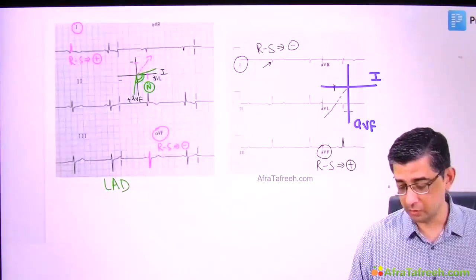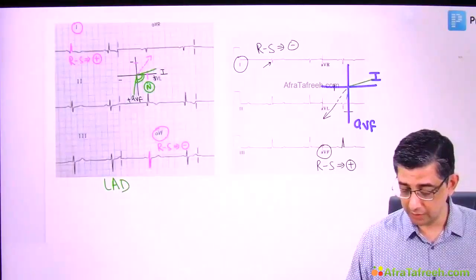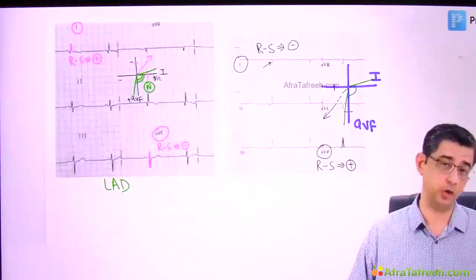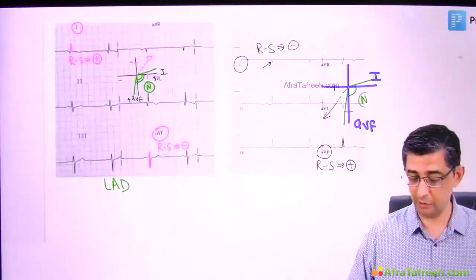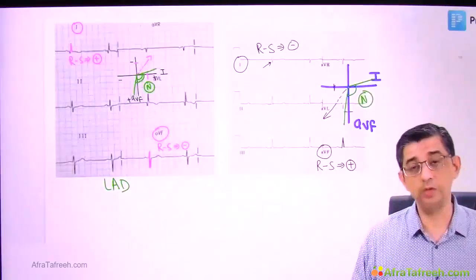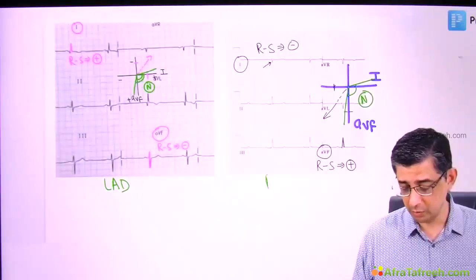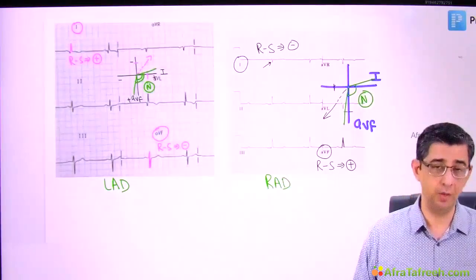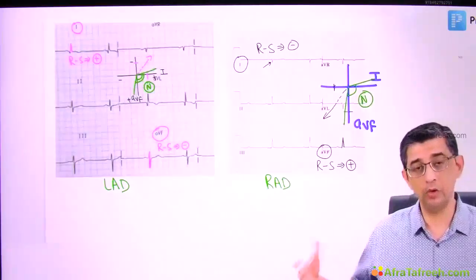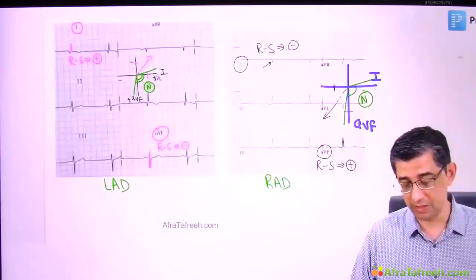And if I join the two, the vector is going to be dramatically, or I would say significantly, distant from what I had mentioned earlier. The normal range was what I represented in green, -32 to +110. This is turning out to be fairly away. So I agree that nowadays we have computerized systems and we don't need to actually bother with all this. But because this is given in the protocol, in the textbook, it is my job to sensitize you to how we do this basic activity.